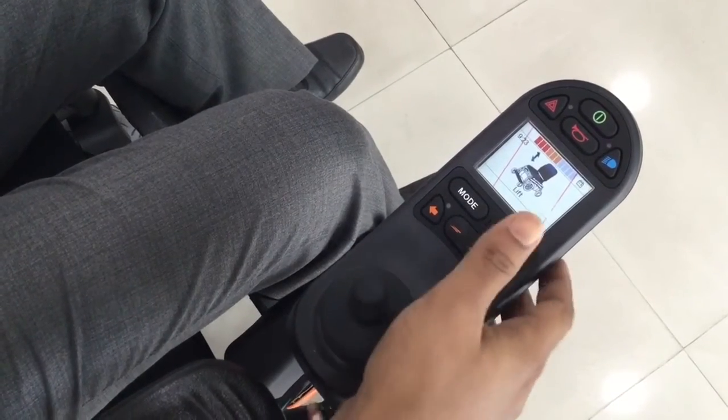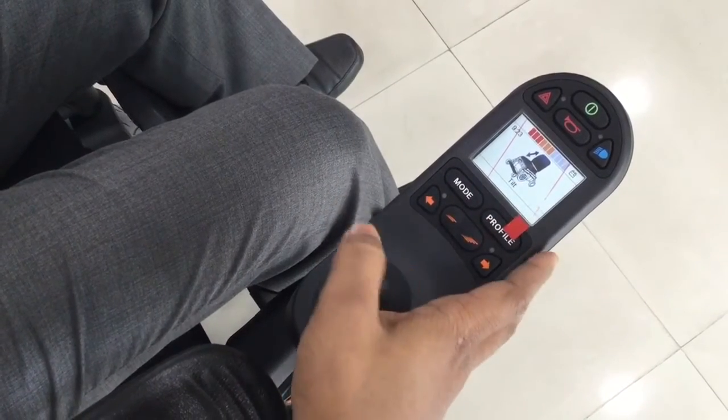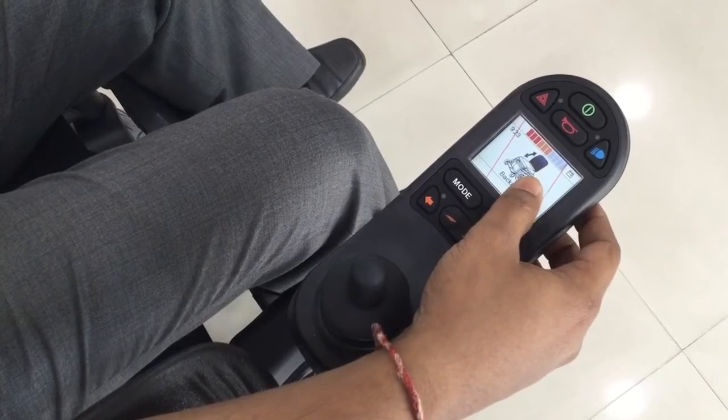It's for the wheelchair lift purpose. It's for the tilt purpose, and it's for the backrest recline purpose.